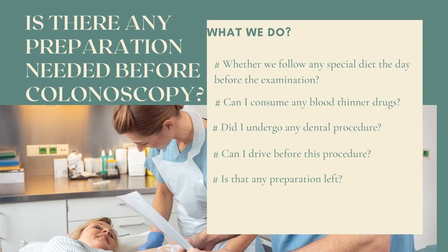Did I undergo any medical procedures or dental procedures? The doctor should be alerted if in the past patients have required any antibiotics prior to a surgical or dental procedure to prevent infection. Can I drive before this procedure? Driving is not permitted for 24 hours after colonoscopy to allow the sedative time to wear off. Before the procedure, the patient should make some plan for riding from home to the hospital.